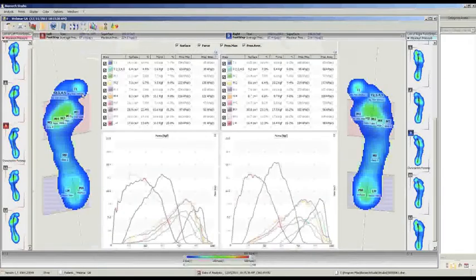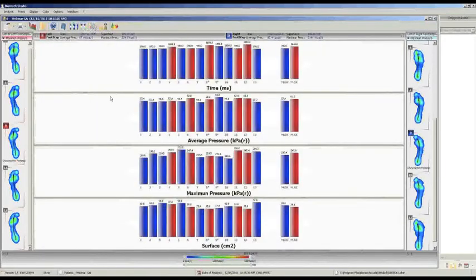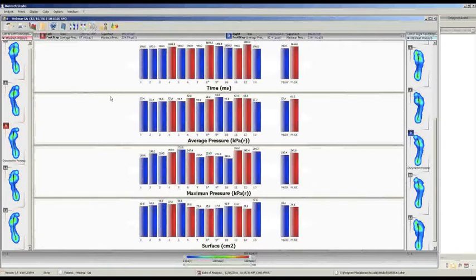Then we have another visualization about the force during each footprint and the different kinds of overload of the foot. Then we have another visualization in histograms to evaluate the duration of contact, the average pressure, the maximum pressure, and the surface for each contact of the foot on the ground. The histogram view is very important because we can see for how long we stay in a particular position of the foot — whether there is overload of the heel, the internal contact, the external contact, or the last part of the foot.